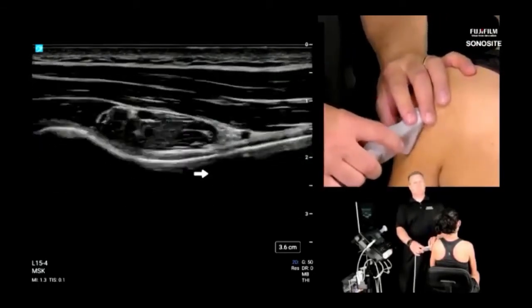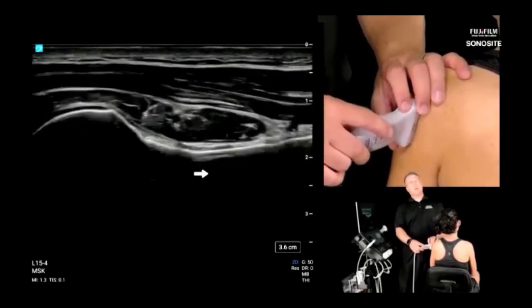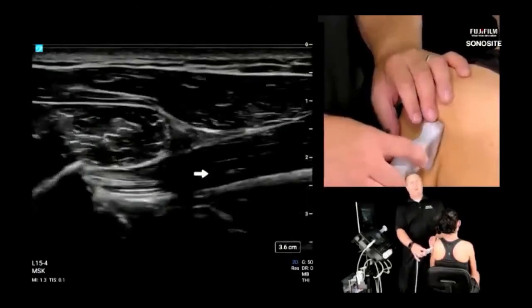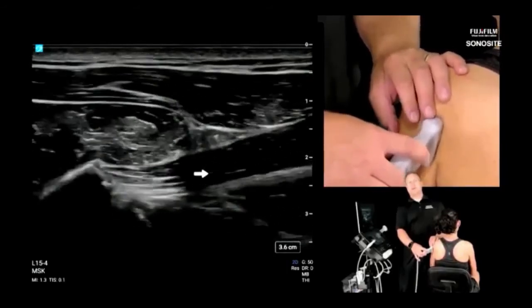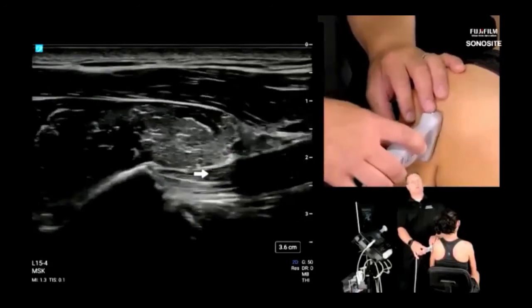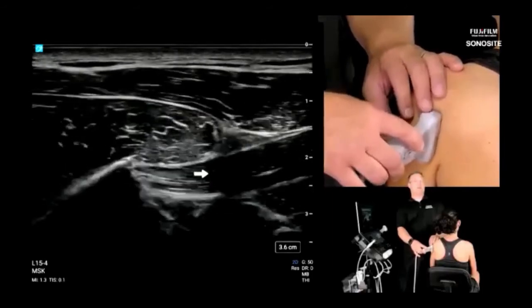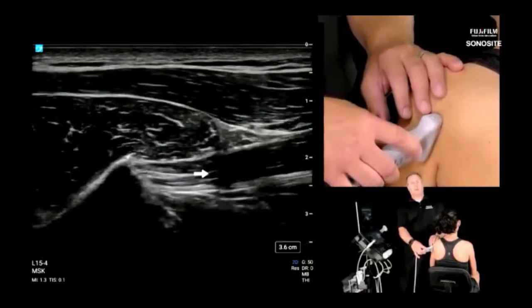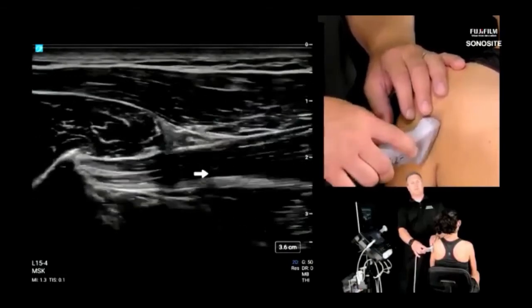And then last question is, how accurate is scanning for scapular winging with MSK? Winging. I've never really done that. So I'll have to ask one of our sports specialists that we have on staff. We have a couple of athletic trainers, for example. That would be another really good one, I think. Okay. But I've never scanned for the scapular winging. So give me something to study for. Or I'll just go to our athletic training experts that we have on staff and maybe have them as a guest, and maybe we can cover some of those more dynamics that are not a part of a rotator cuff protocol. Okay, that sounds great too. I'll definitely keep that name on hand, and we can get back to that person after the webinar.